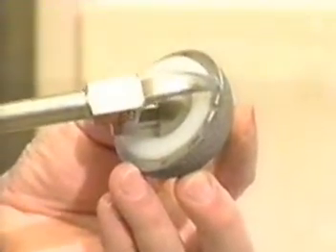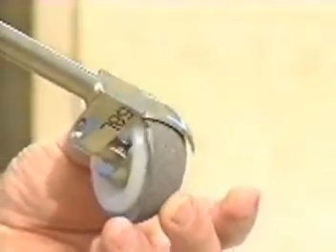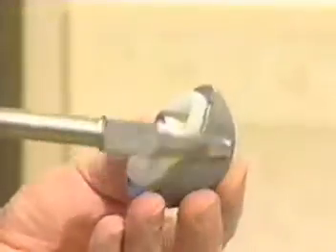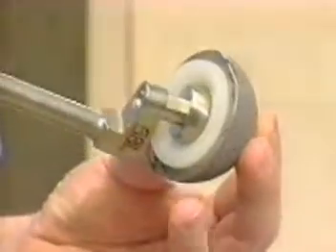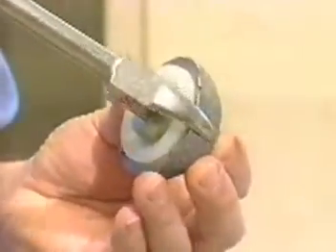After that, we put in the second instrument, once again centered with the longer, thinner blade, and simply tap the blade around to the apex of the cup, to the pole, all the way. When you've divided all the bone and the soft tissue with this instrument, you remove it and simply lift the cup out.